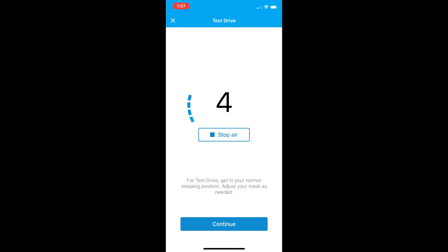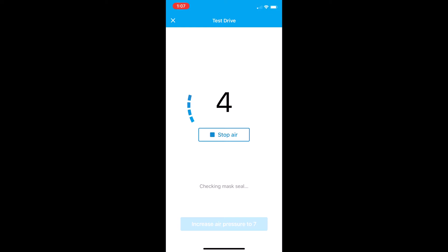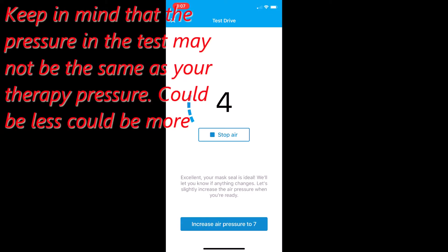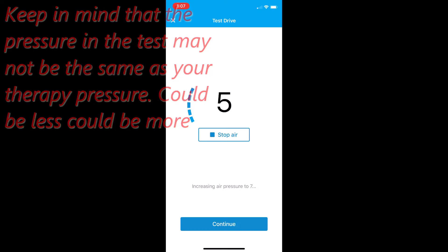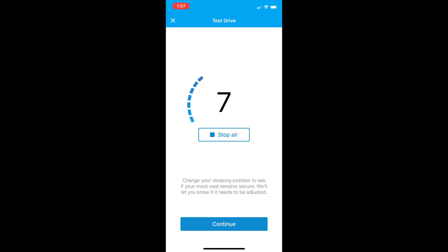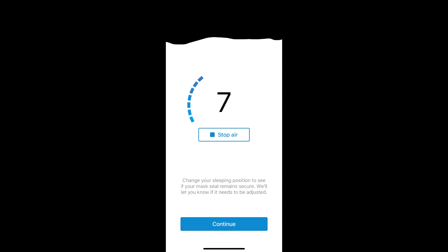For test drive, get in your normal sleep position. Now let's check your mask seal. Excellent! Your mask seal is ideal. Increasing air pressure to 7. Relax and breathe normally. Change your sleeping position to see if your mask seal remains secure.